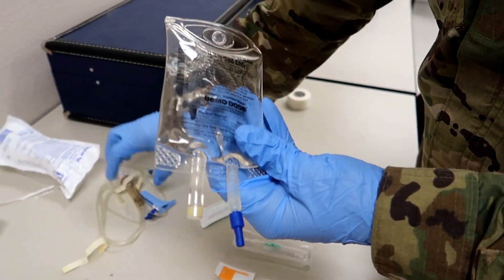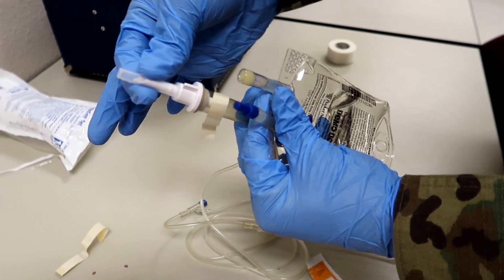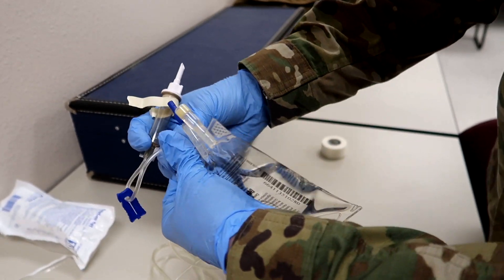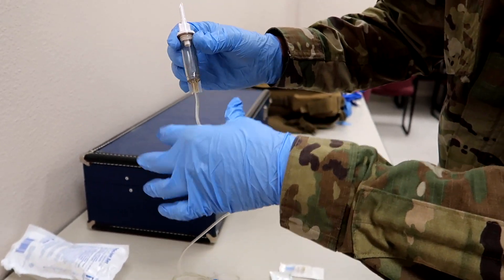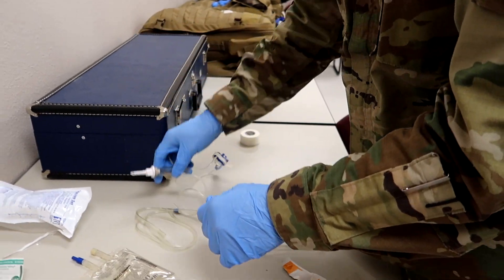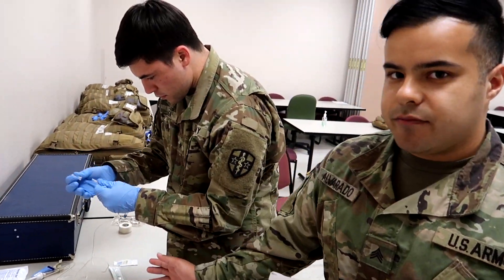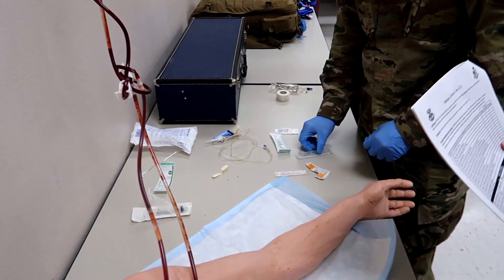For demonstration purposes we're not going to actually puncture the bag, but when you do it you're going to pull this little blue tab right here and grab the cap, then puncture the exposed site once you pull the blue tab. You're also going to occlude the line — grab the wheel and scroll it down to lock the line. From there grab the drip chamber, squeeze it twice, and it's going to fill up about halfway — that's where you want to leave it, no more no less. That's all part of your gather, inspect, and prepare step. So now he's going to spike the bag and properly prepare the IV tubing.